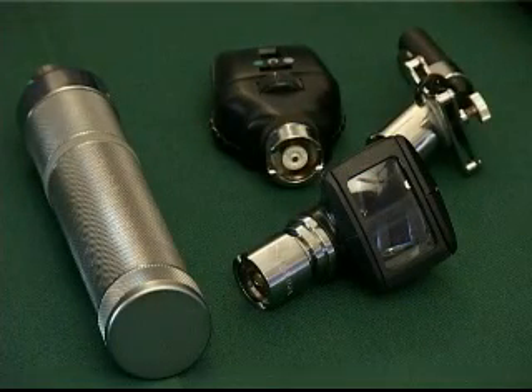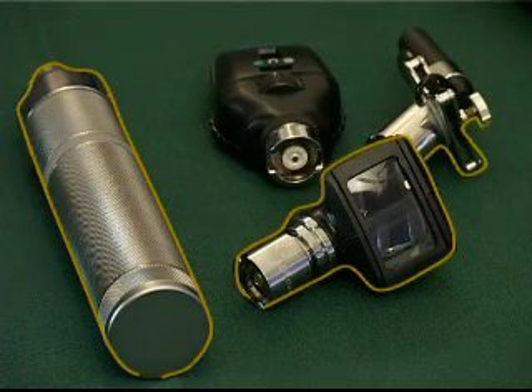For the purpose of this training module, we will concentrate on the power handle, the otoscope and the tongue blade holder.